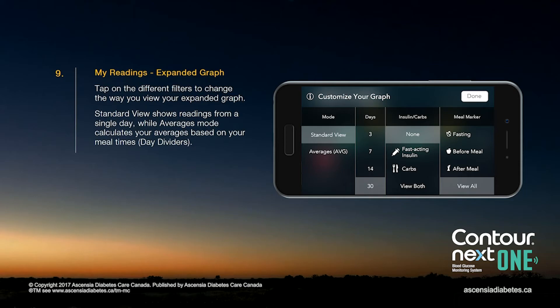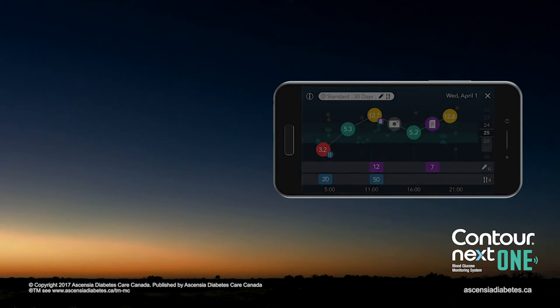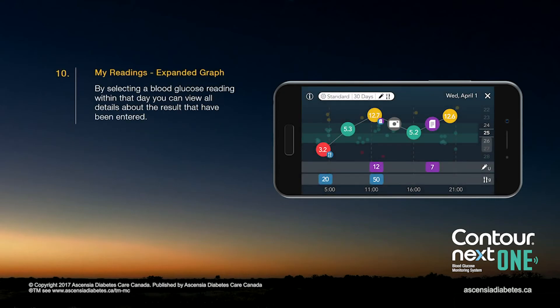Standard view shows readings from a single day, while averages mode calculates your averages based on your meal times. By selecting the blood glucose reading within that day, you can view all details about the results that have been entered.